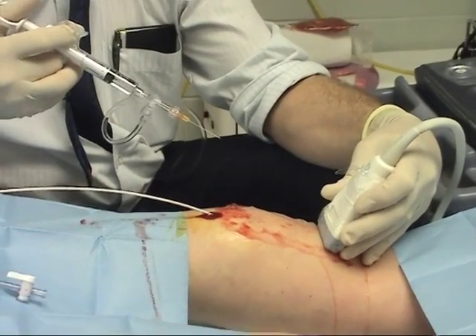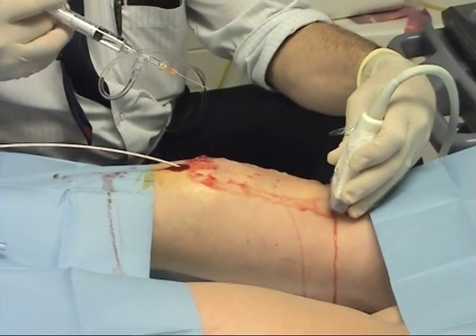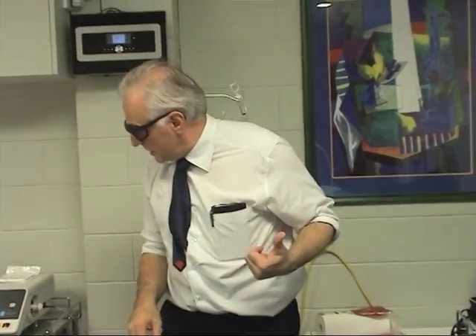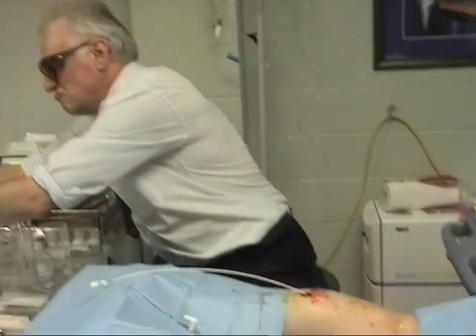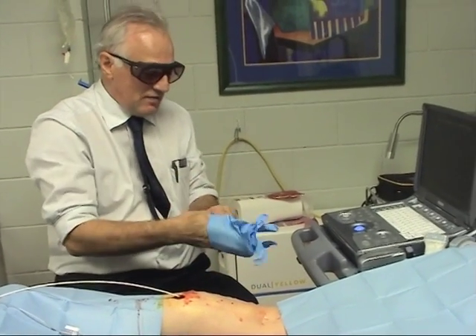It looks very good — good coating there. That's the long bit done. The next bit is very quick — doing the lasering. When I fire the laser you're going to just hear a bit of a beep, and that's about it. But you may taste something — sort of a barbeque flavour.